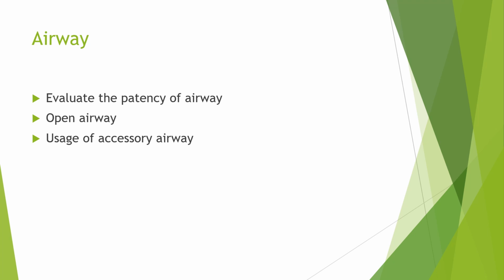During the airway evaluation, we will evaluate the patency of the airway. We will try to open the airway, and if the airway is still obstructed, we will use accessory airways.